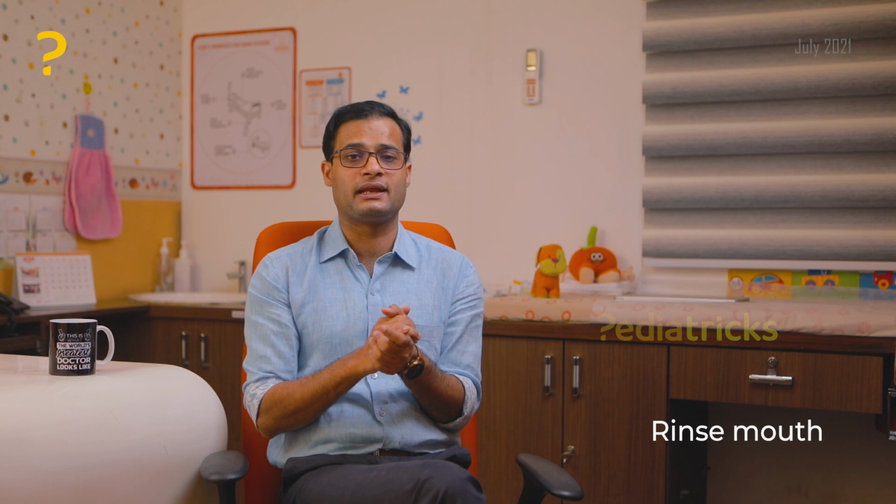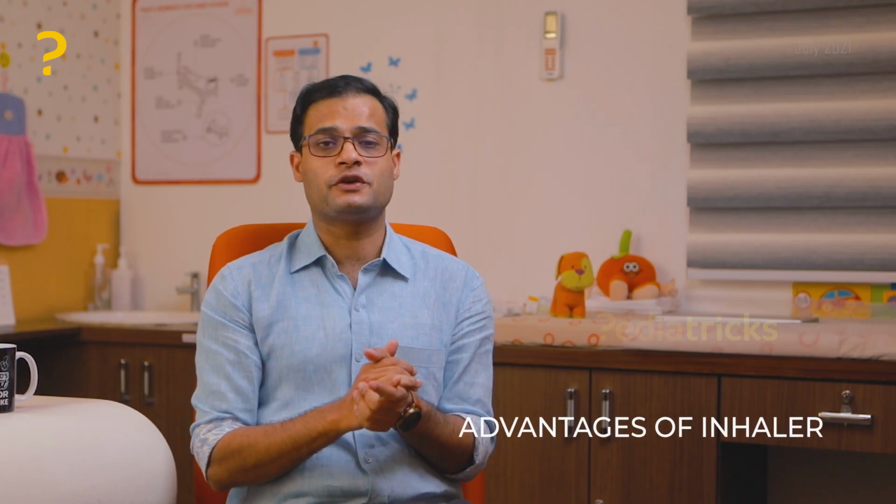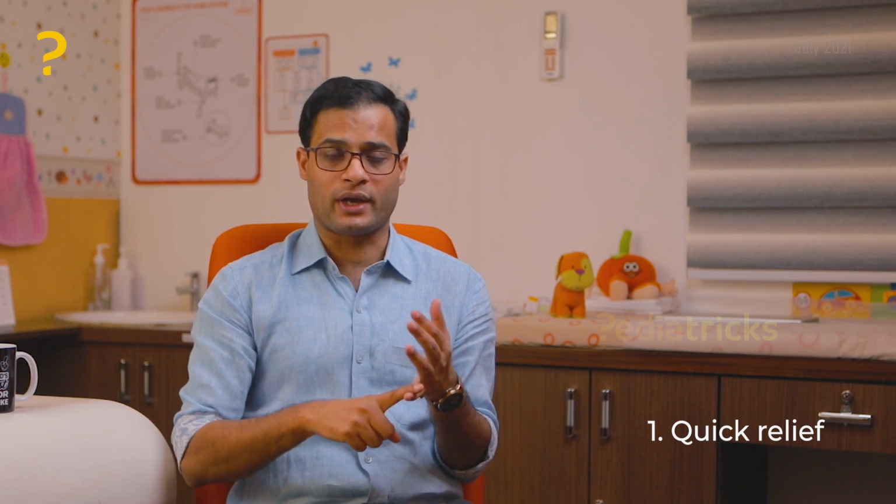Immediately after using inhaled medications, ask them to rinse their mouth, especially after inhaled corticosteroids. It is better to brush the teeth along with it and drink a little bit of water. The advantage of an inhaler over oral medication is that, as mentioned for the nebulizer, this medicine is directly going into the lungs, and so the relief is quite quick.